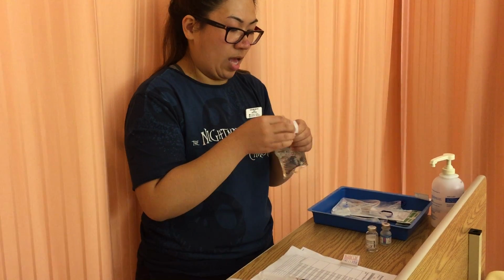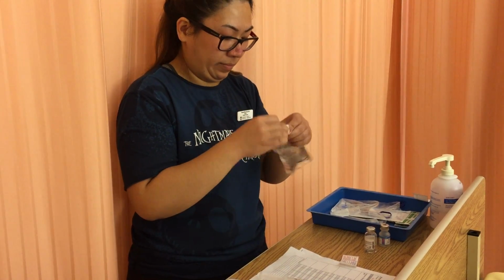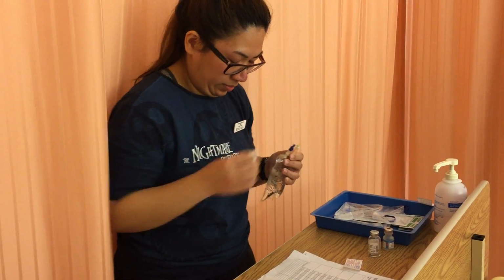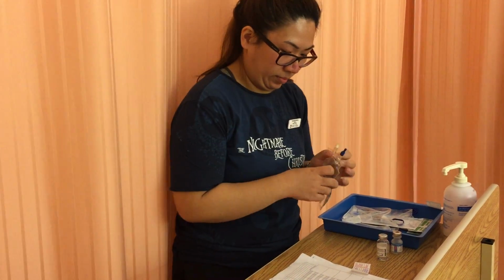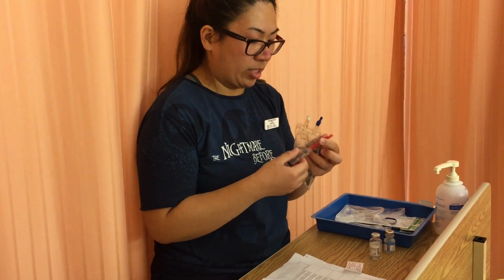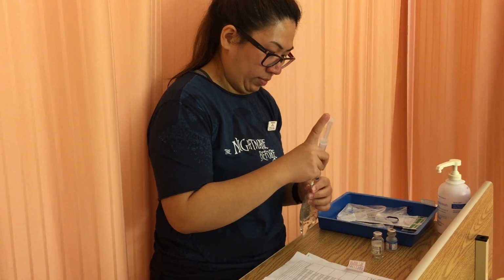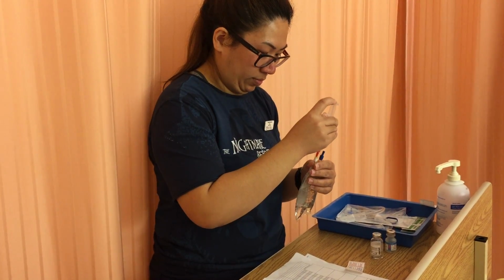Then I'm verifying as well. I'm going to clean the port, and verify that everything is clean for about 30 seconds. Make sure both ends are clean. I also watch out for different evaluations, and make sure that the patient does not have any allergies.